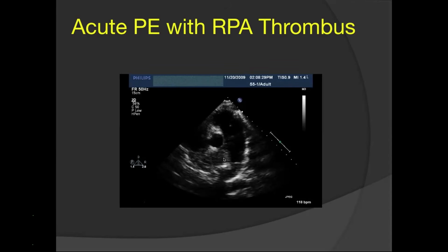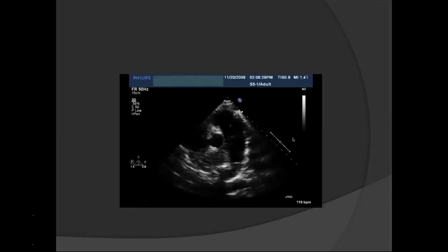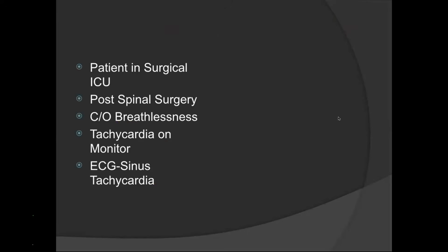Look at pulmonary artery bifurcation in most of your patients. Sometimes you will find thrombus here and the diagnosis is already made. So a very good scenario to pick up by echo. Usually we do not go this far. We do not look at these very clearly. We measure the pulmonary artery here and we stop at that. But try to make a habit of looking at pulmonary artery bifurcation also. You will not miss out on this diagnosis.